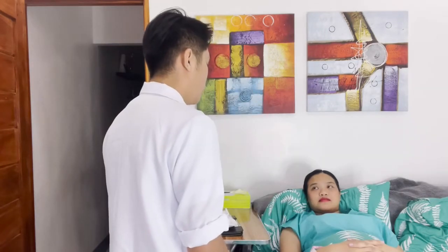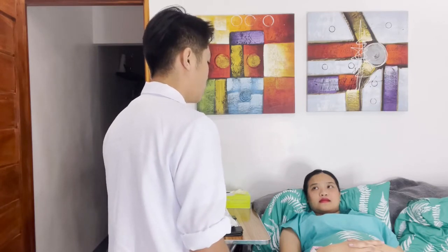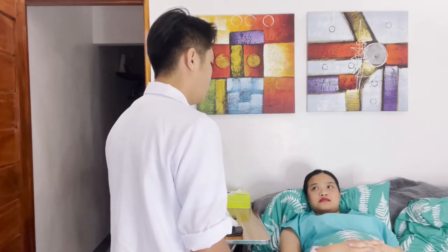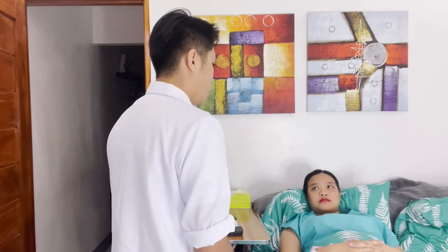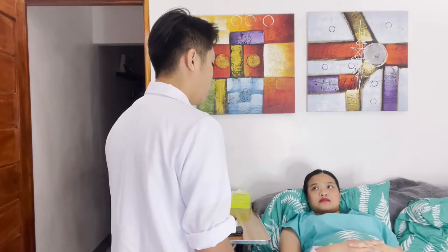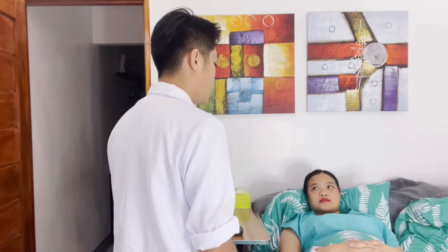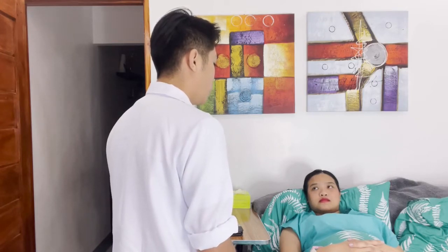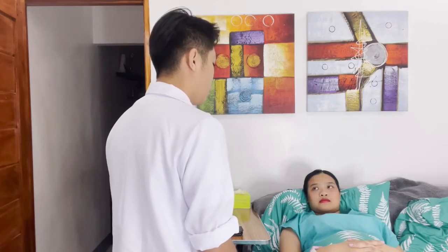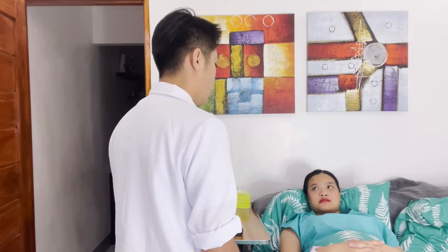So, ma'am, for today, I will be inserting an NG tube, which is a soft tube that goes in through the nose, down the throat, and into the stomach. It will provide you all the nutrients and medicines that you need. But I want to make sure that you're aware that it will activate your gag reflex while inserting. That's why you will feel a little bit of discomfort. You can cooperate by letting me know if you're in distress by raising your hand, so I can pause the insertion and let you rest, take a few breaths, and take sips of water to calm the gag reflex. Okay, ma'am? Okay.